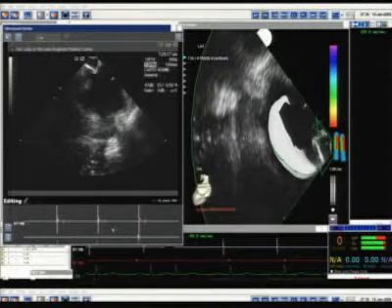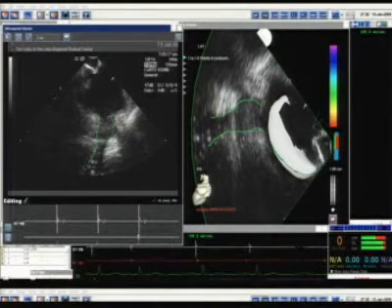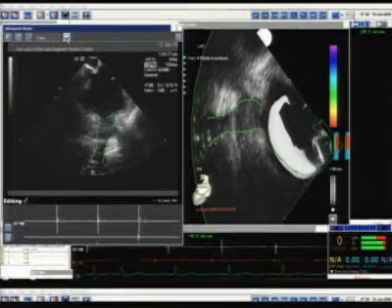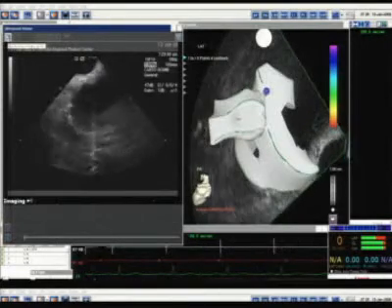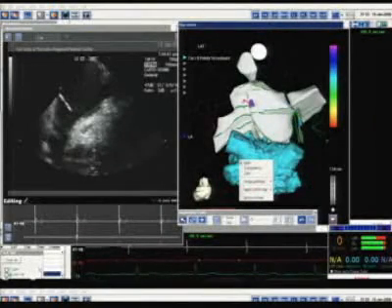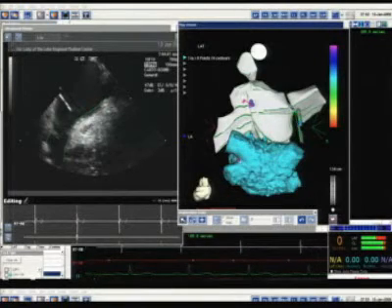All right, what are we looking at here? So what we're looking at here is actually the intracardiac echo images of the heart. And what our nurse is drawing is the left inferior pulmonary vein. And what she's creating is a three-dimensional map from a two-dimensional image. So both fluoroscopy and echocardiography are two dimensions. But by taking different planes in the heart, we're able to reconstruct a three-dimensional image.